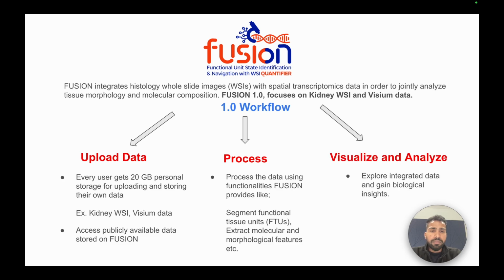And the third and final step is to visualize and analyze those integrated data. They can do this directly on top of histology, or they can make different kinds of plots to find out the correlations and biologically meaningful insights.